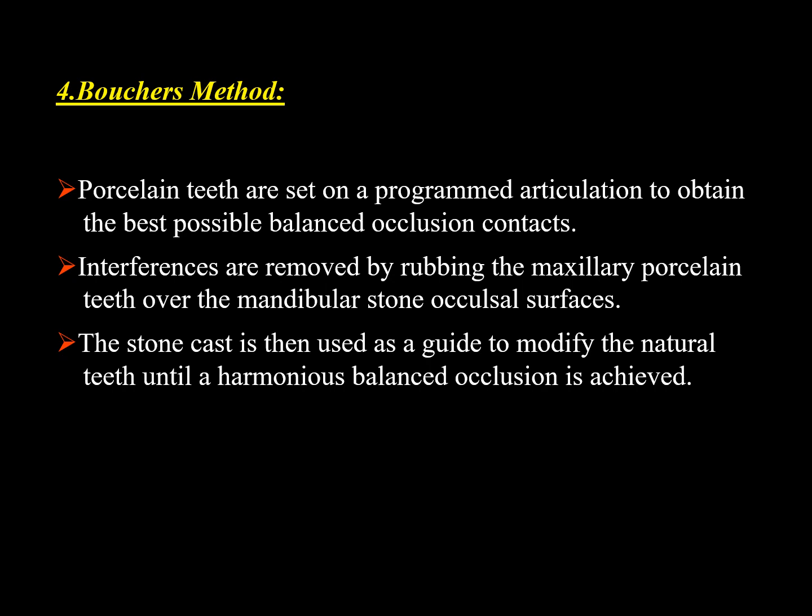The stone casts are then used as a guide to modify the natural teeth until a harmonious balanced occlusion is achieved.